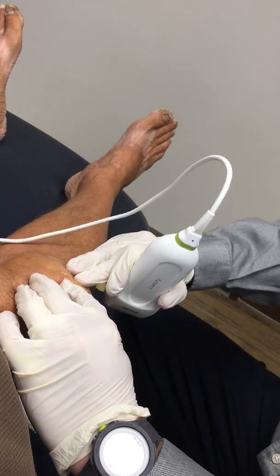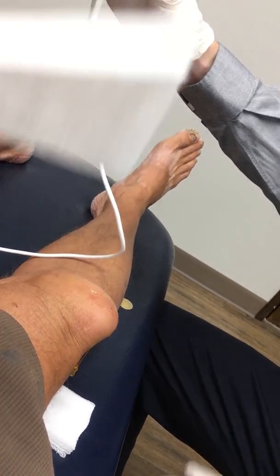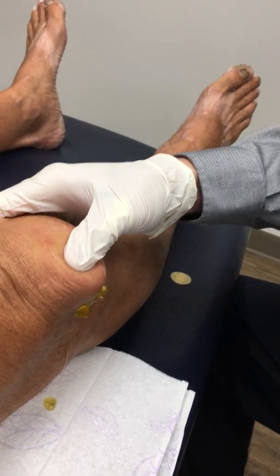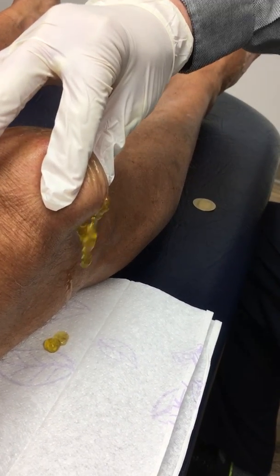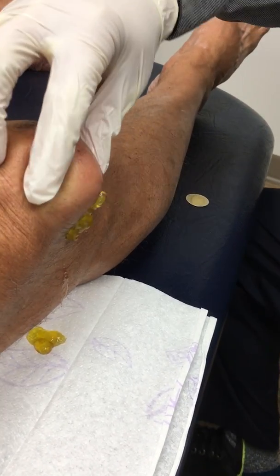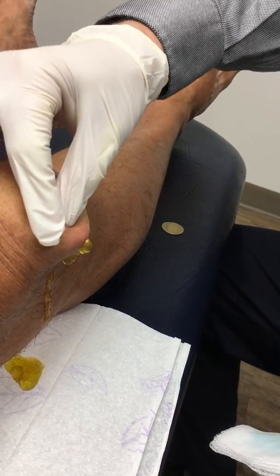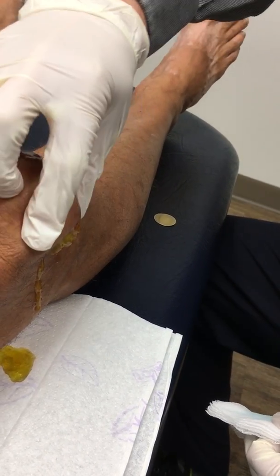And this would be a little bit gross. I'm going to maybe pass that back to you for just a second. Thank you. And I'm just going to manually, and can I get another gauze with chlorhexidine on it? Not to be disgusting, I apologize, Reed. She's like, wow. I'm going to sit over here. So that's the really, really thick, gelatinous material. And that's what a really chronically inflamed bursitis can look like.